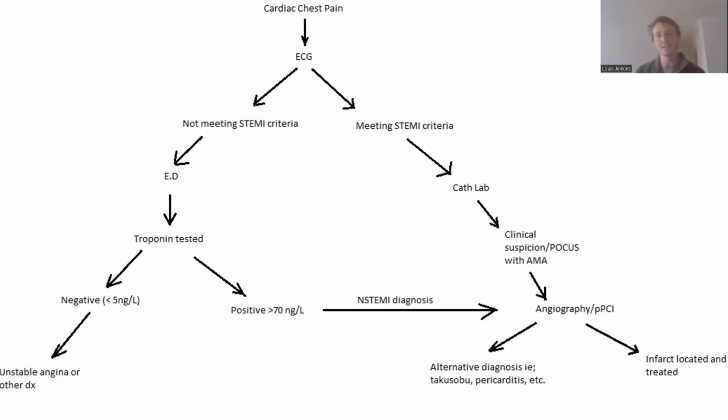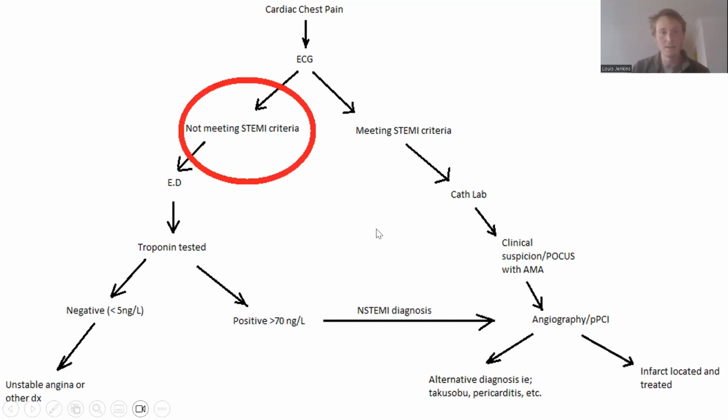And the primary decision point that's going to determine disposition for most of these patients is going to be whether their ECG can demonstrate a STEMI or not. Okay. So this group of patients here in the process are the ones that we're going to really focus our case-based analysis on today. So this is the main concept I want to get across.